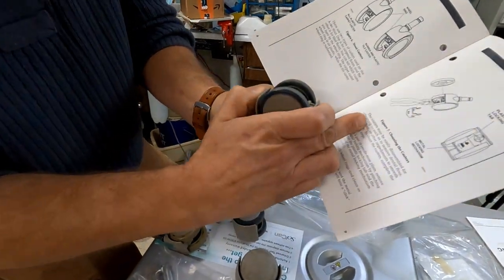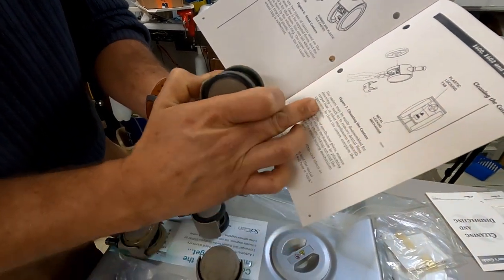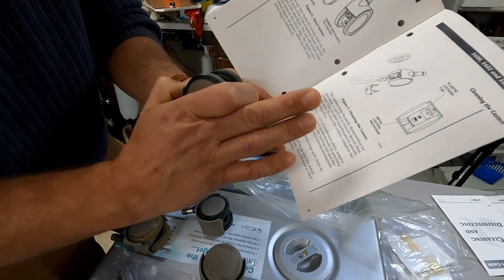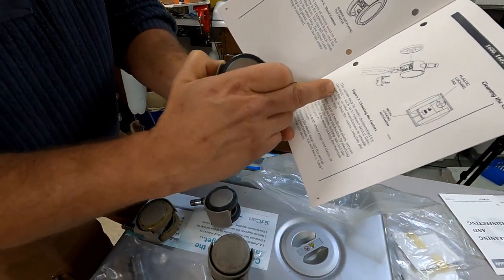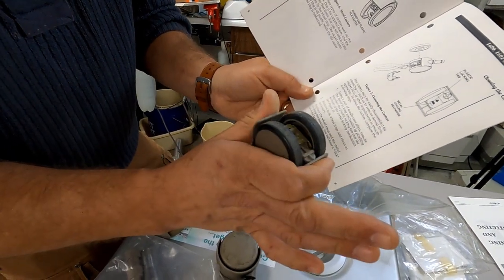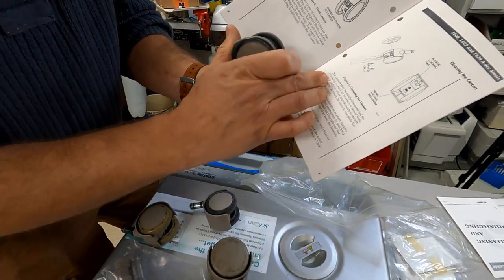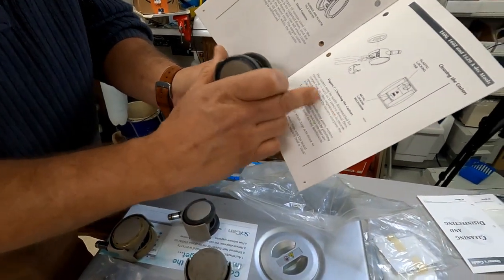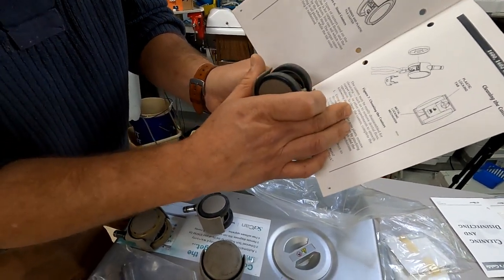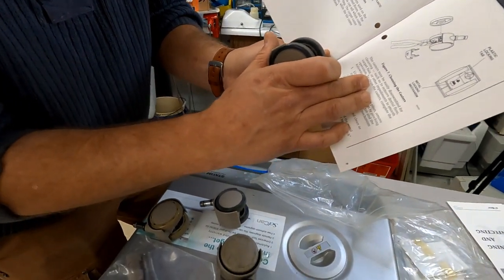So the casters may easily be disassembled for cleaning, such as the removal of dental floss, carpet fuzz, or other impediments to smooth operation. Now, I'll make a little aside here. If you have carpet fuzz in your dental stool casters, it's time to upgrade to solid wood floors, because carpet is really unsanitary. But anyhow, you can get things out of your wheels. And they didn't say girl's hair, but girl's hair gets in this a lot, or long-haired man hair, which applies to some of our better looking members of our team.